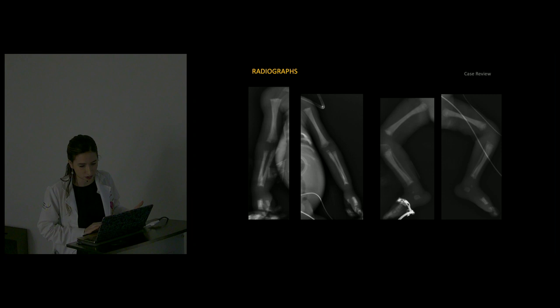This is positive for congenital syphilis. A detailed evaluation of the tibial metaphysis is limited, as I mentioned before, secondary to the patient positioning, therefore we cannot see the presence of erosions along the proximal tibia, which is classified as a Wimberger sign. We will see that later. This cannot be assessed. There is no evidence of pathological fractures in these projections, only the lucencies of the metaphysis that I referred to previously, and the generalized periostitis of the long bones.